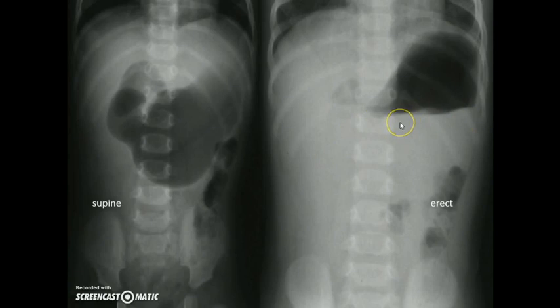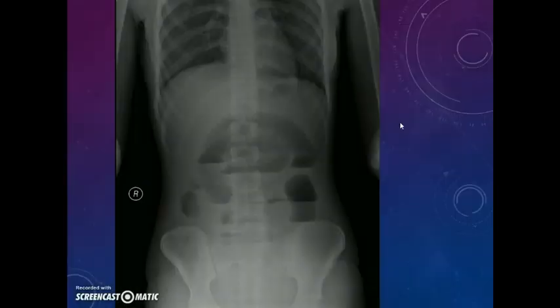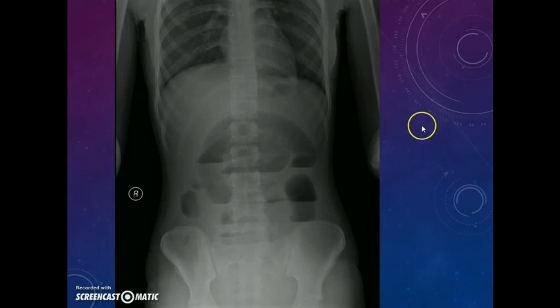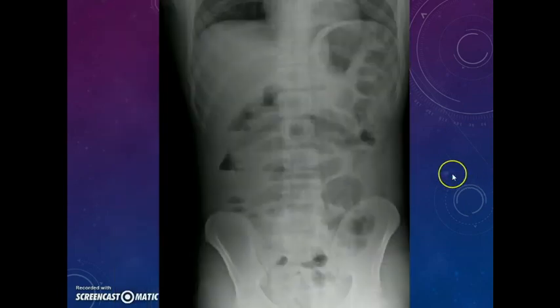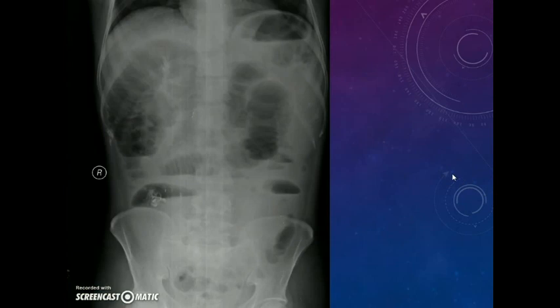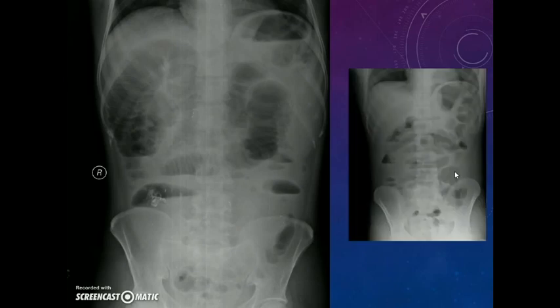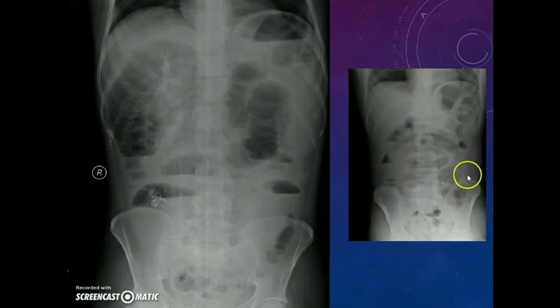This is the supine view and this is the erect view. This is a case of multiple air fluid levels. We will see air fluid levels when we take an erect X-ray. This is another X-ray showing multiple air fluid levels in an erect view. Now, this is the same patient in the supine position. Can you see the difference? There are no air fluid levels in the supine view, but the erect X-ray shows the multiple air fluid levels.